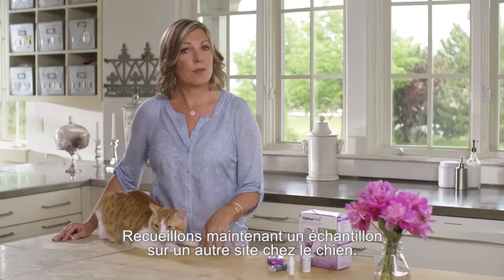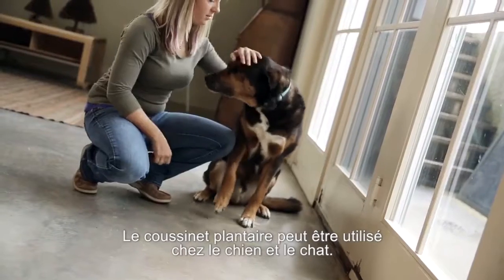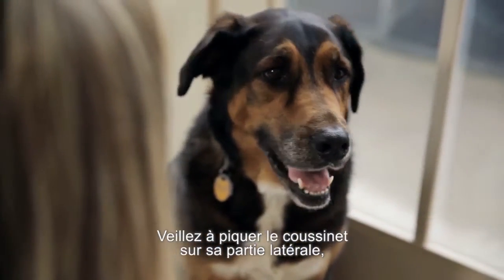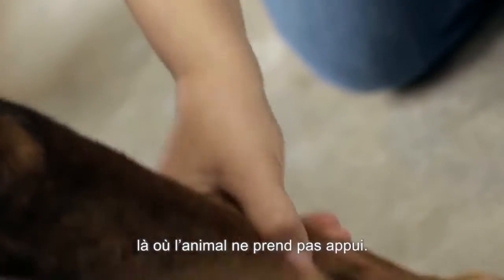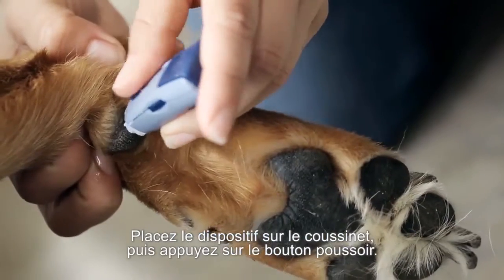Let's look at how to get a blood sample from other areas on a dog. First up, the paw pad, which could be used on both dogs and cats. When lancing a paw, find an area on the side of the paw that your pet doesn't step on. Press and hold the lancing device to the paw pad and push and release the button.